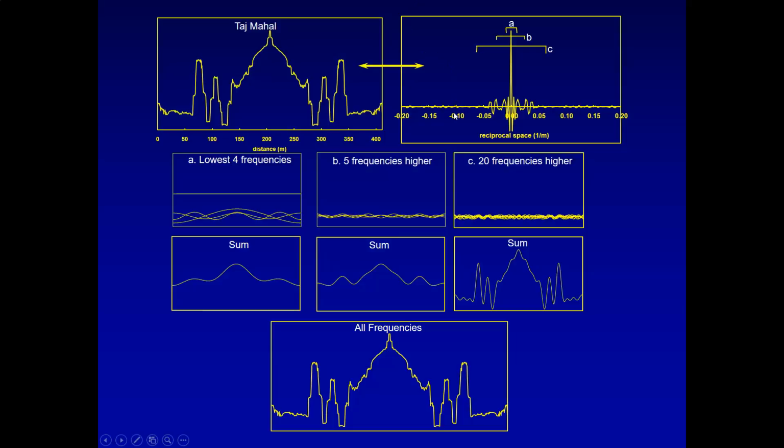Well, we get data that look something like this picture at the upper right-hand corner, and we have to do a Fourier transform of it to convert it to an actual picture. And the reciprocal space or K-space is, for most people, an odd idea. It has units of 1 over distance.